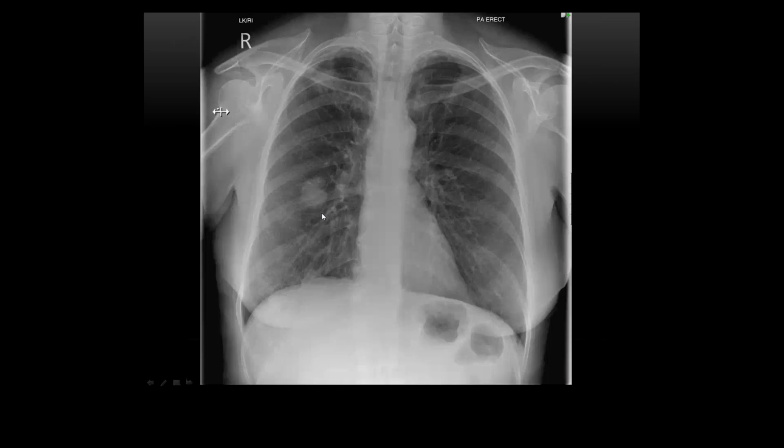So I think this one came back as the primary with a net in it as well. So it's just a good satisfaction of search one. Like I said, any abnormalities, you see it, bank it, look at everything else and go back to it. And it's the same when you're looking at MSK as well, because a lot of the time with fractures, you're going to have a few fractures. So see the fracture, ignore it, look elsewhere, and then go back to it.